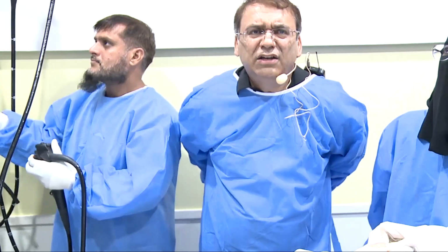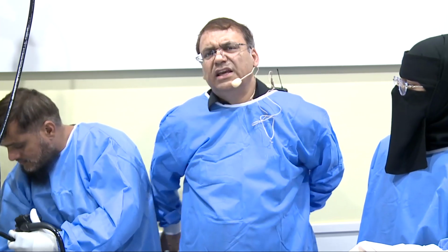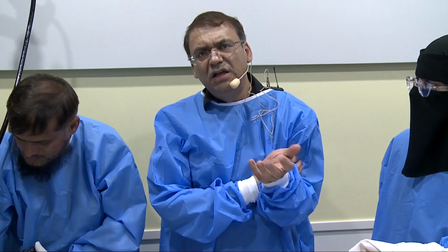Rectal EUS for staging is not used much because I think MRI does a lot better job for rectal cancer staging. But if something needs to be biopsied, something needs to be drained, or looking at the fistula, it could be very helpful.